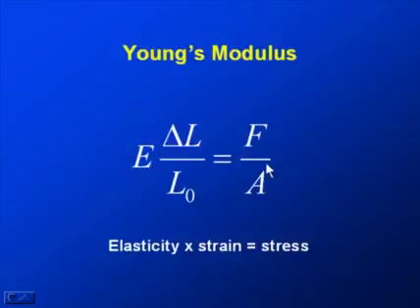Now this is a quantitative parameter that's measured in kilopascal, but most elasticity imaging systems cannot capture this directly, so we choose to depict the strain instead, the relative displacement as a function of time and baseline. There is some equipment coming on the market now that can do this, and we'll talk about this as we go on.